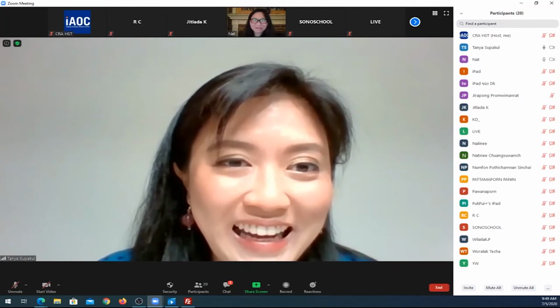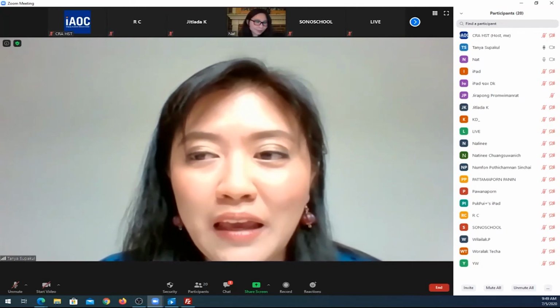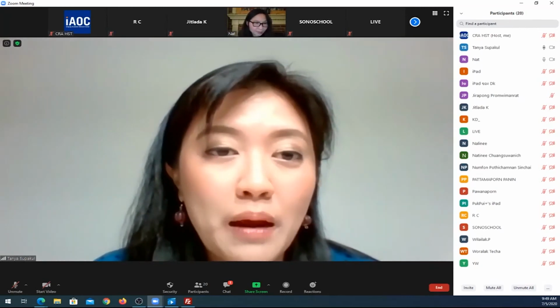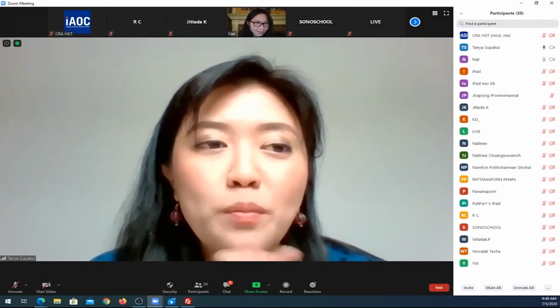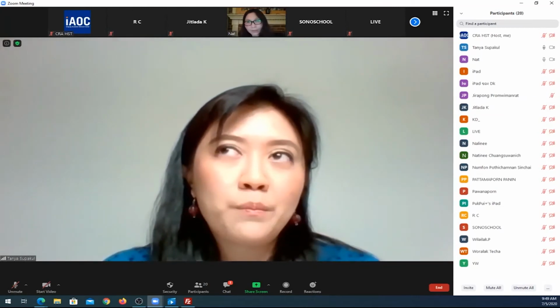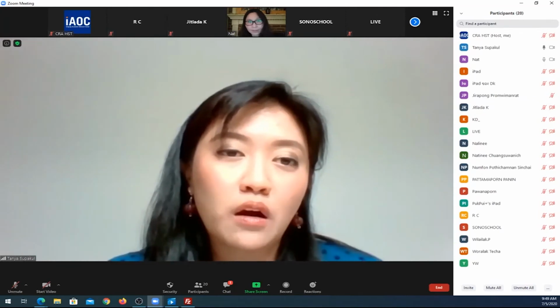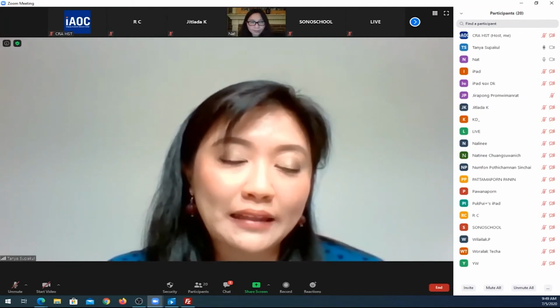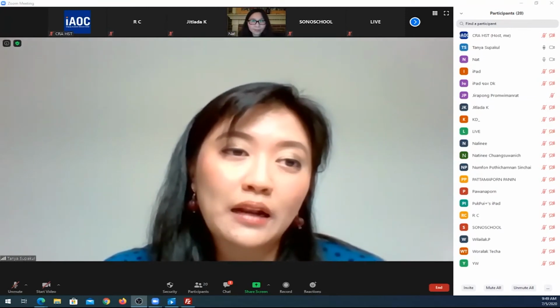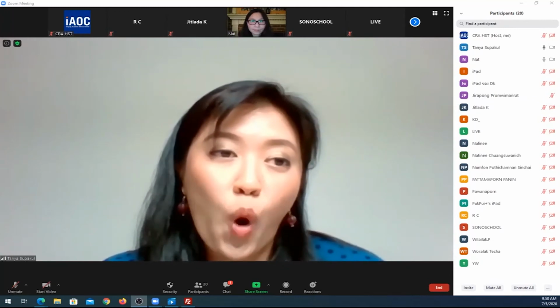You mentioned dual energy and spectral CT with the PE protocol, and you said when you have good bolus tracking you don't need that, but when you don't have good bolus tracking, dual energy and spectral CT will help with the image quality.